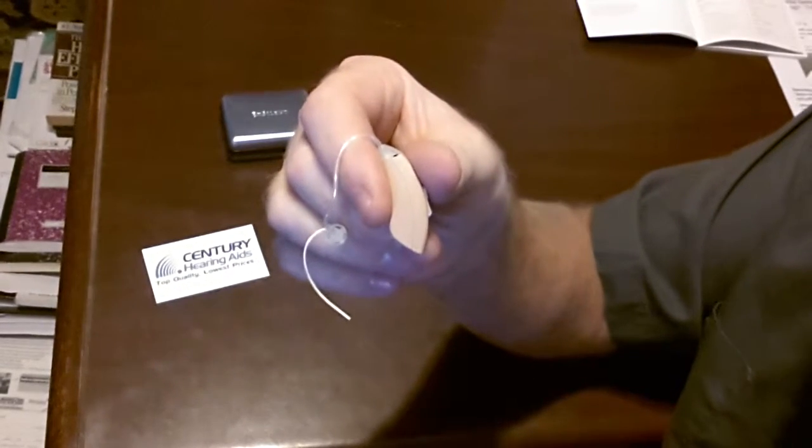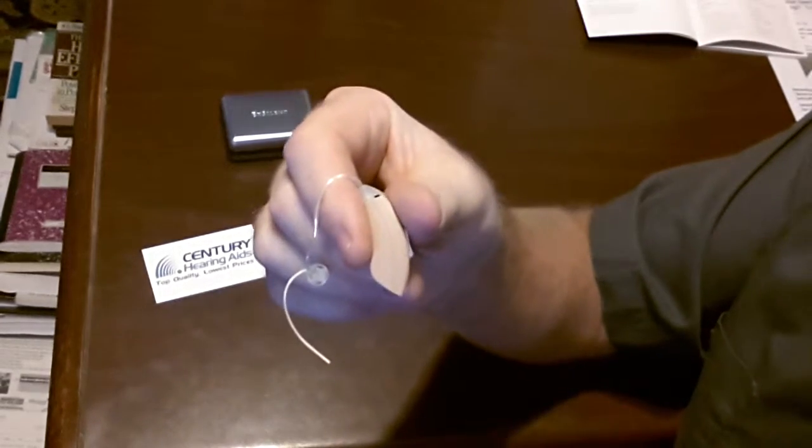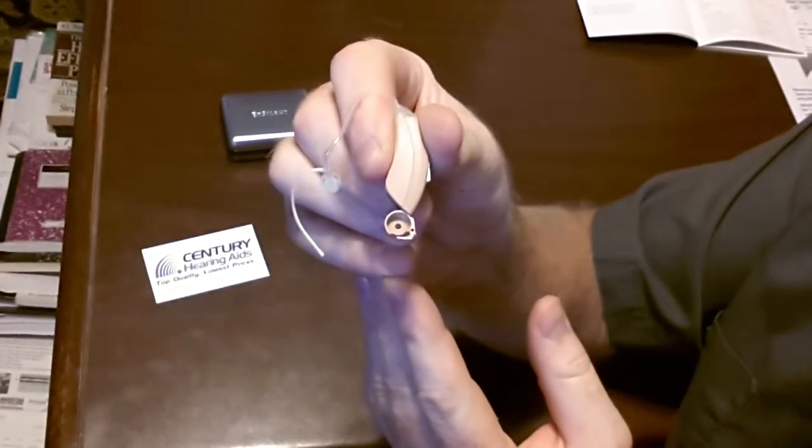How to replace the battery in your OpenFit hearing aid. Hold the hearing aid with one hand, find the latch on the bottom with your fingernail, pull down, open the battery door.